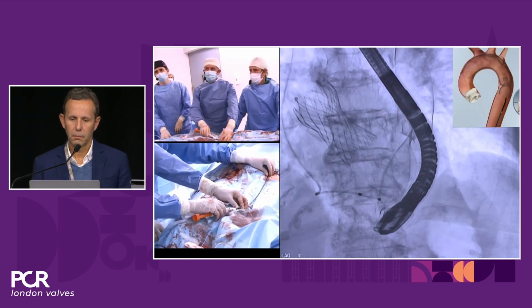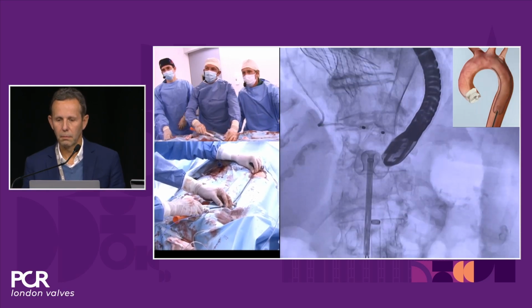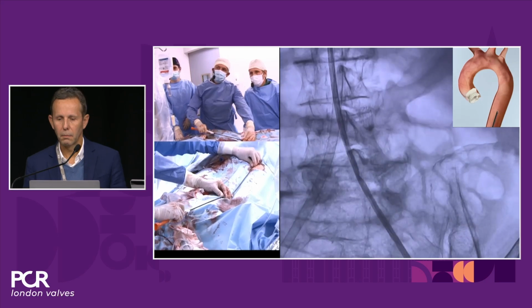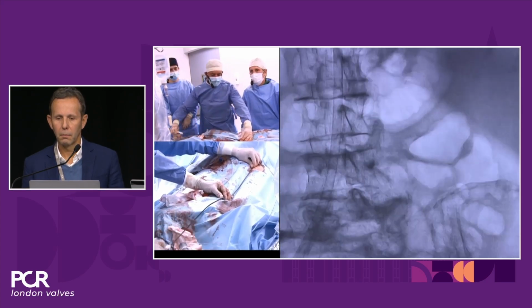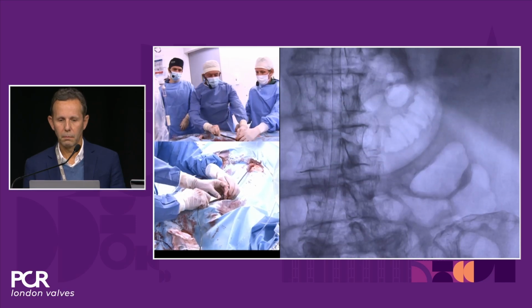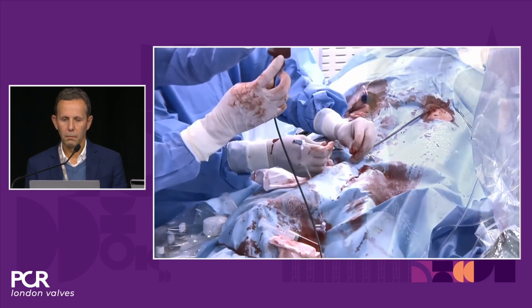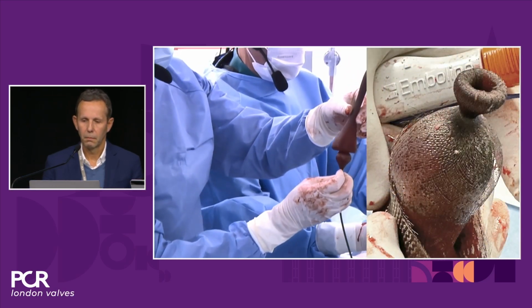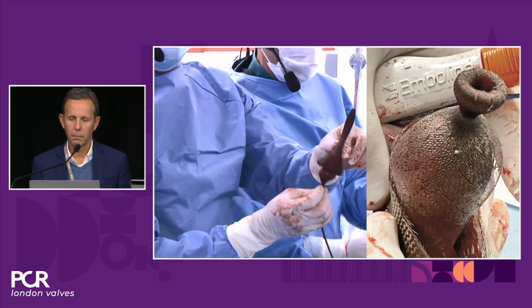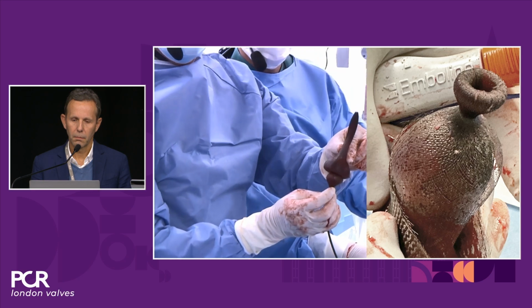So now it's time to retrieve the Emboliner. It's getting inside the catheter. The port is going to straighten up, and everything is going to be inside the catheter. And if you see my hands here, you see how it looks. You see, all the debris should be inside this bag over here. This is going to be sent to the US, to Renu Virmani's lab, to be able to analyze independently the amount of debris we capture inside versus what we capture in the filter with the Sentinel.